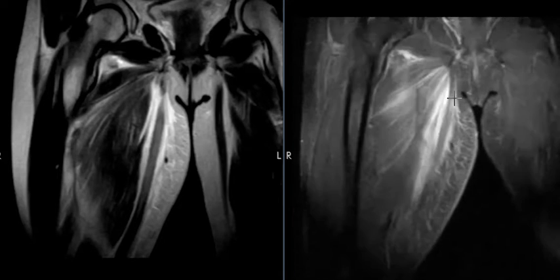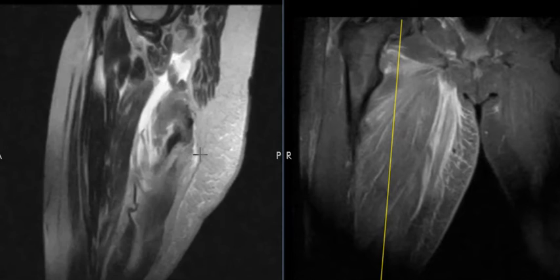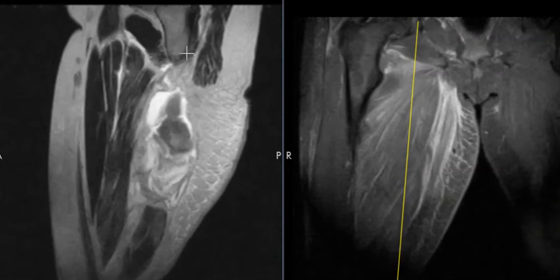I almost forget it exists, but I saw it in this case, and then earlier, I had another case of the distal gracilis. I'll show that one here. But before I do this, I want to show a sagittal view, side view of this. This is the front now of the thigh, back of the thigh. The buttock would be up this area. This is that bony protuberance, the ischial tuberosity.